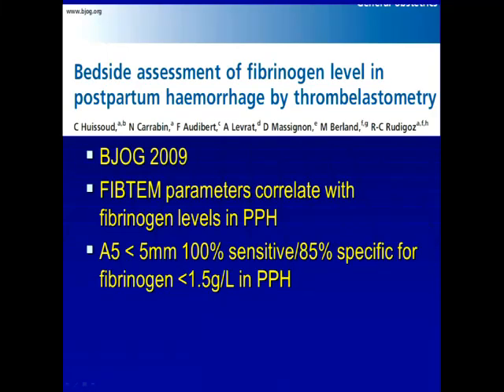Is there a plan to have all cardiac sites, or if all sites are going to have ROTEM, to have the same platelet function monitor right now? Because that would make sense with all the teaching and stuff that goes on, for consistency.